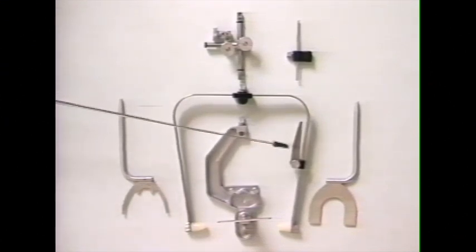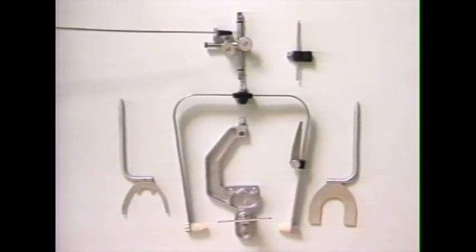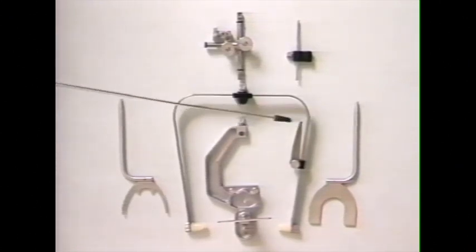The ear bow also has an axis orbital indicator on it, which allows the vertical orientation of the face bow. This is the transfer clamp assembly, which attaches the bite fork or the bite plane to the face bow itself.